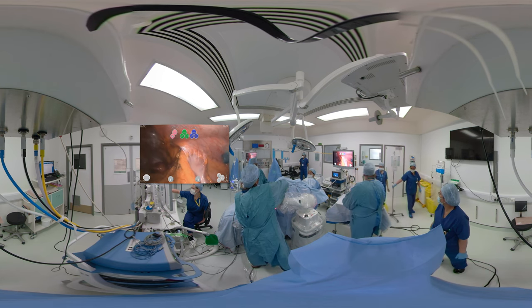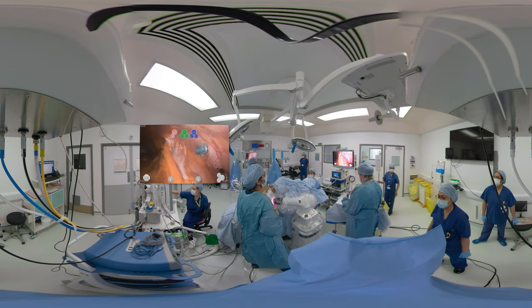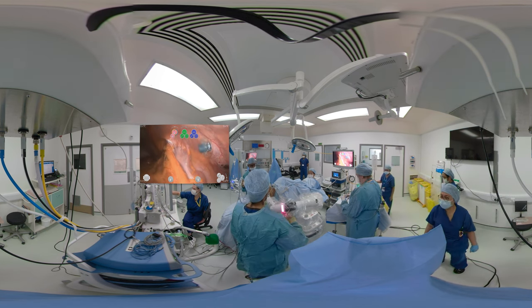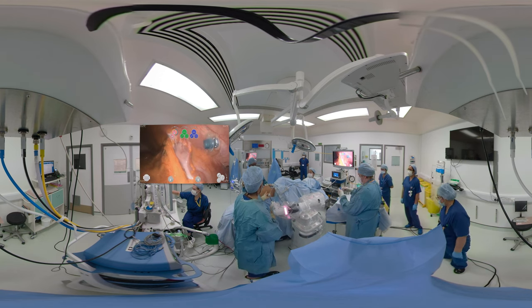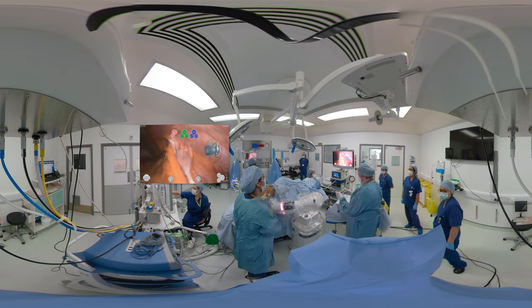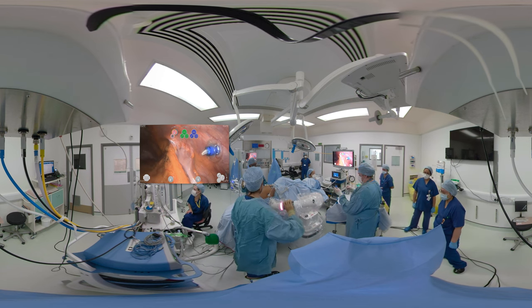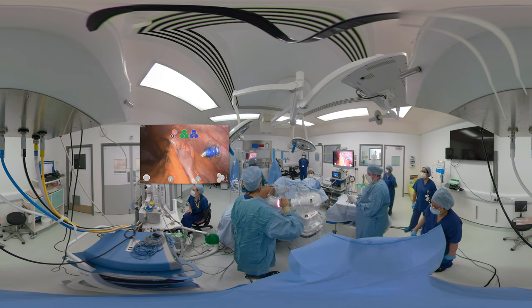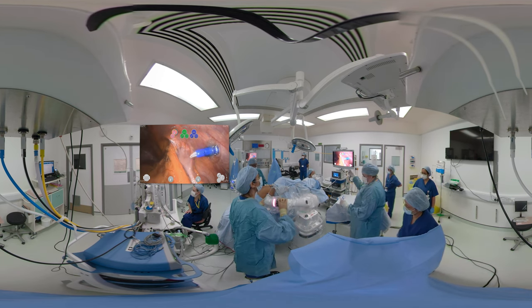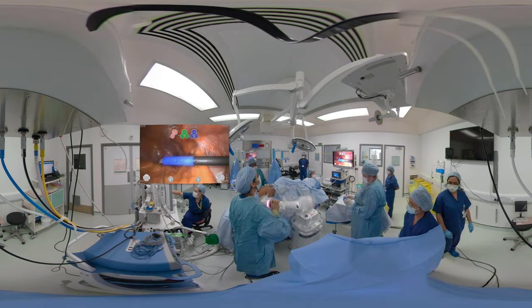I'm now attaching the instrument to the end of the robotic arm on the patient's right hand side and I will perform what's called the port training step. I have attached the monopolar scissors to the end of the robotic arm. I'm going to introduce it so that the tip is just visible outside the port and with gentle circular motions around the port, I'm going to perform the port training so that the instrument recognizes a fulcrum around which it can move inside the abdominal cavity.